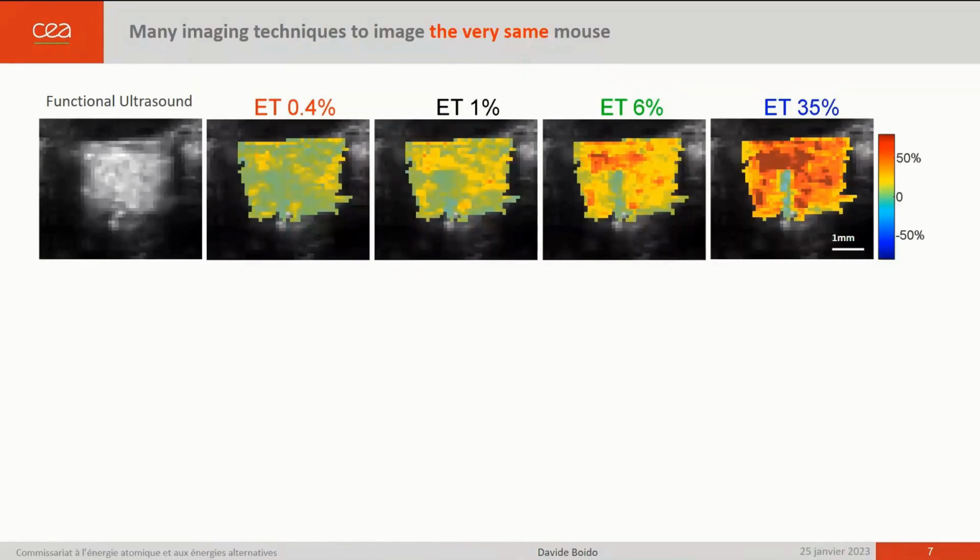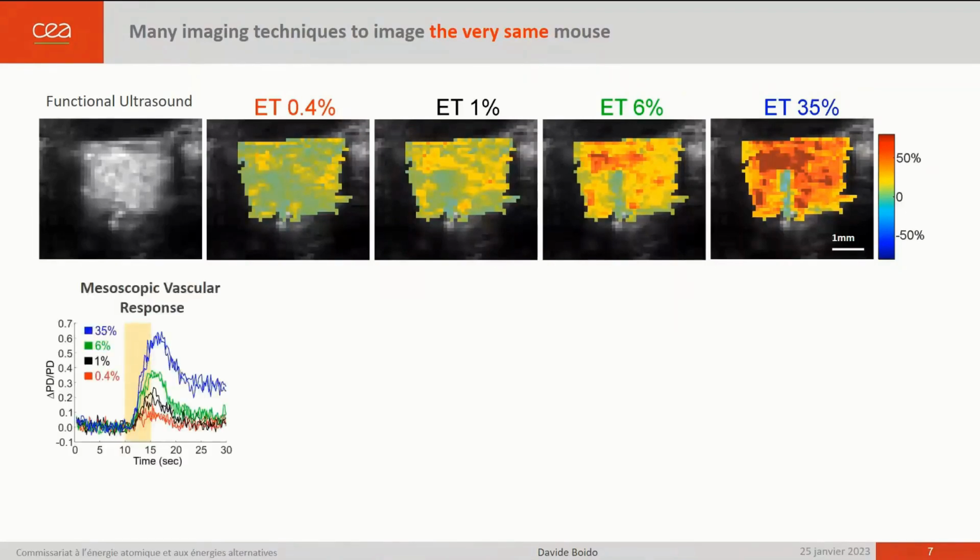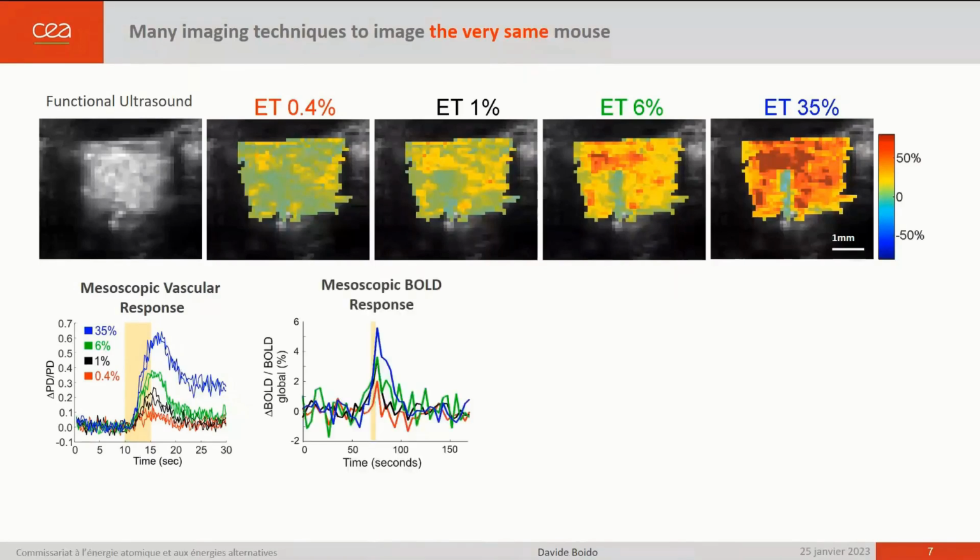We decided to average all the voxels of the slice and to track this value over time. Here below, you can see not the average of multiple odor representations, but two single responses for each tested concentration to point out the reliability of these measurements. Again, increasing the odor concentration, we get a bigger response in time and amplitude.